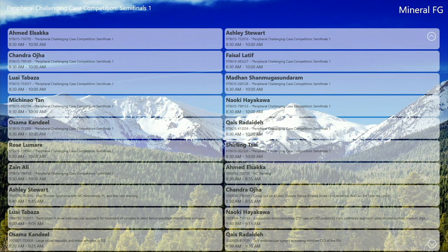Almost the same. Diluted contrast 3 frames, and the normal was 1. Okay. So it's not only diluting the contrast, but also changing the setting on the X-ray that you see so much. Yeah. Perfect. This contrast setting is almost equivalent to the CO2 DSA setting.